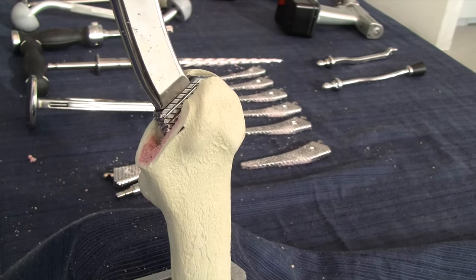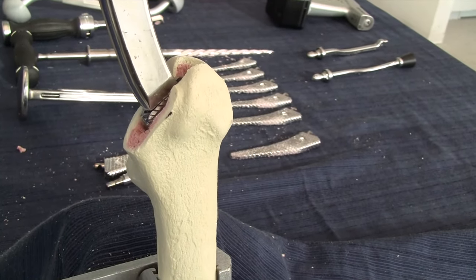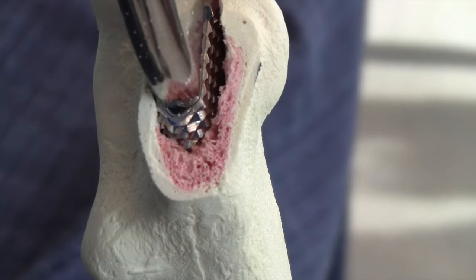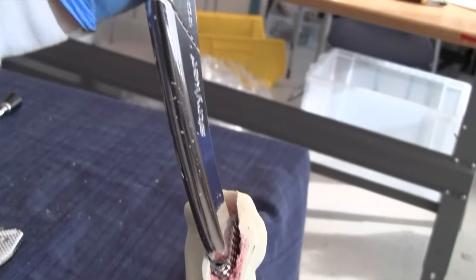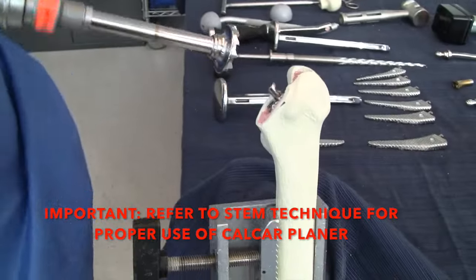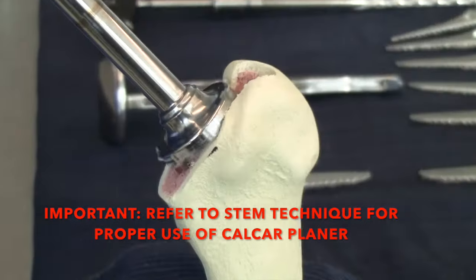Three indications that help confirm the proper size has been achieved include: a change of pitch between mallet blows, increased resistance of forward advancement of the broach, and using the broach handle to confirm rotational stability as demonstrated in this clip. Warning: failure to operate the calcar planer in accordance with the specific instructions found in the surgical technique may result in damage to the femur.